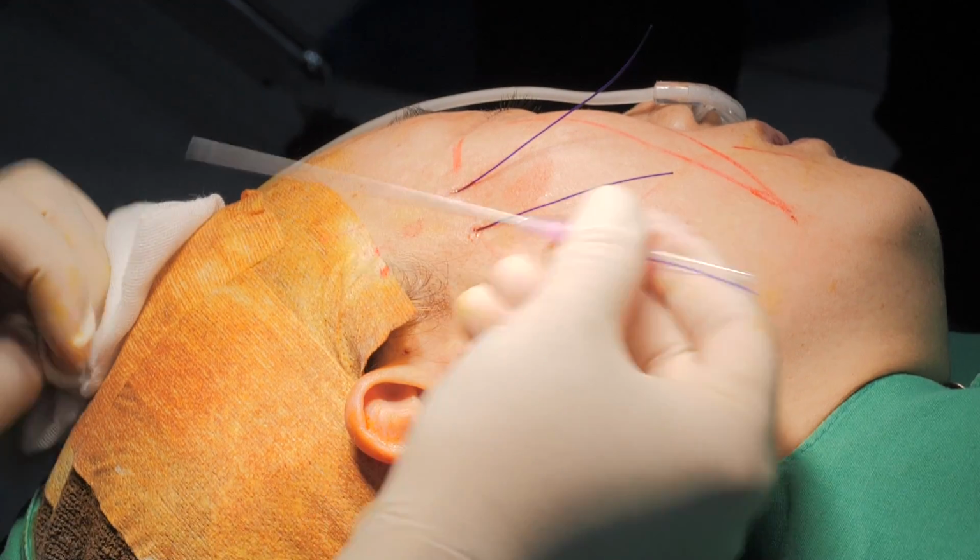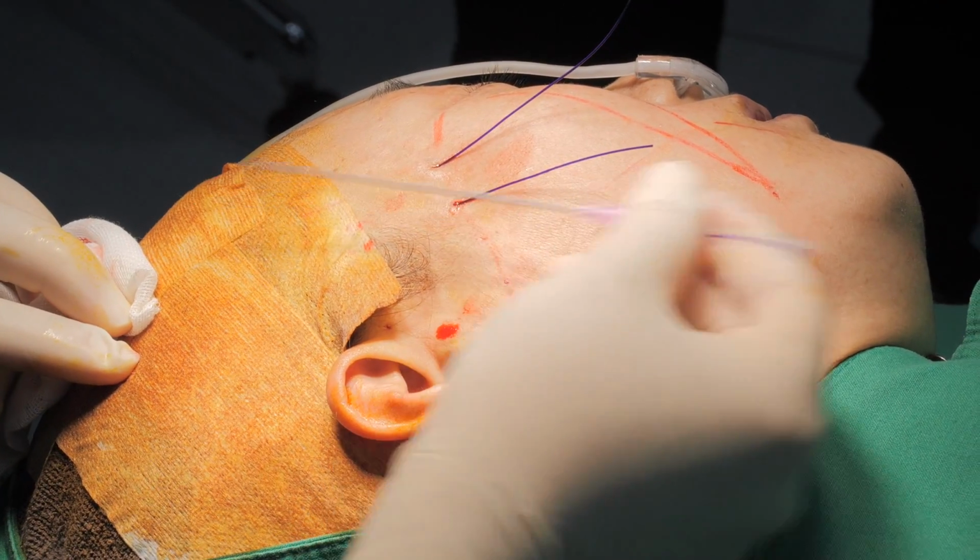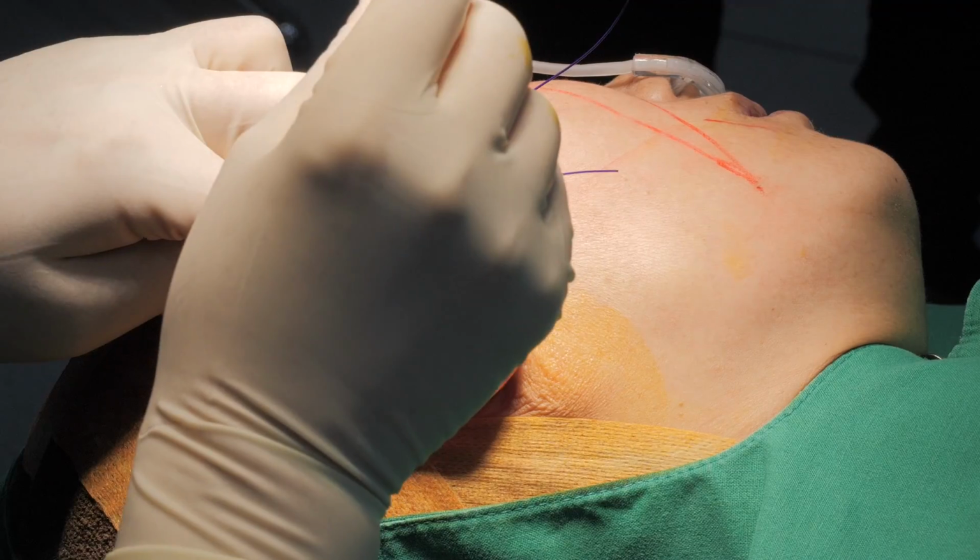But for these two threads, I insert the thread upward.